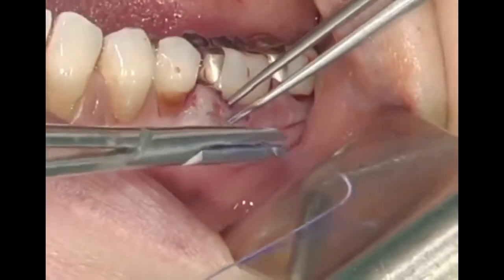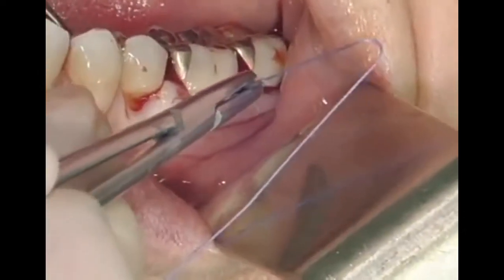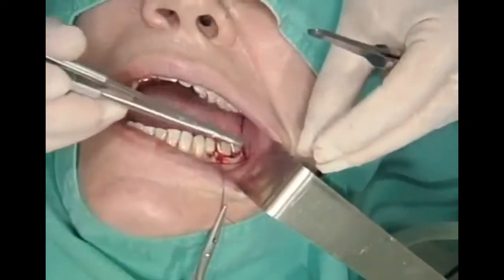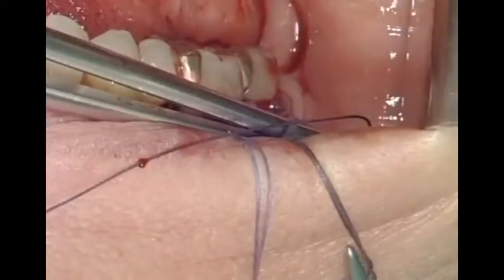Therefore, the site is prepared with modified mattress sutures, using 4-0 suture material with a straight needle. So as to keep the various sutures separate, little mosquitoes are used to retain the different ends of the threads.